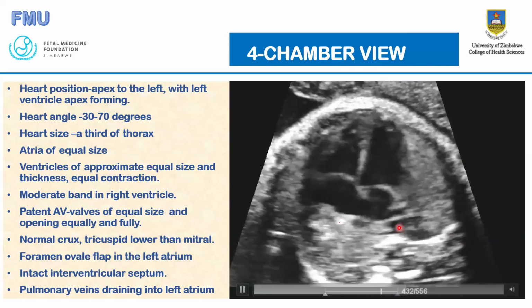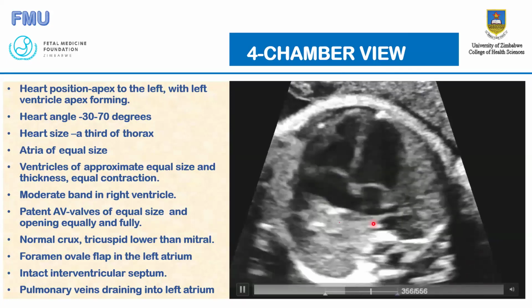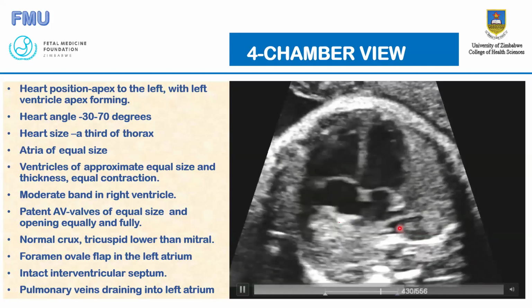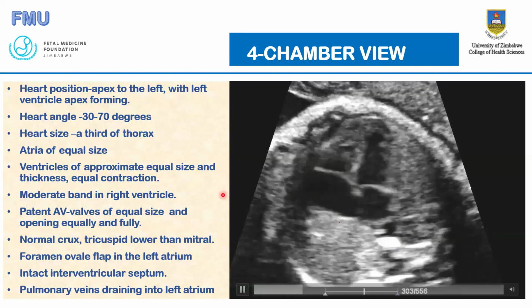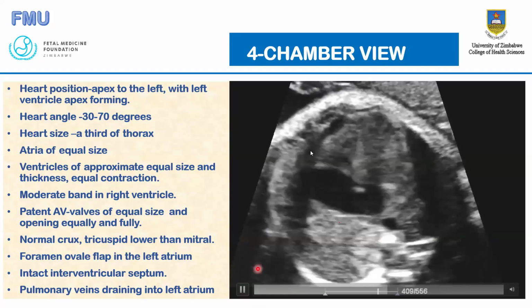If you see more than one vessel here, there is an issue going on, and this baby needs to be referred to the fetal medicine unit for fetal echo. So you should not see more than one vessel here, no matter what. Great.